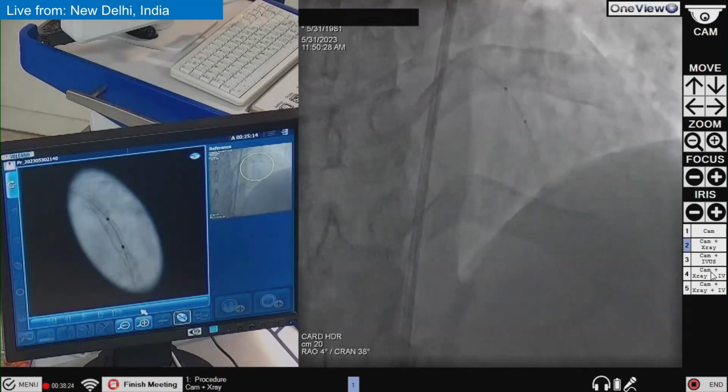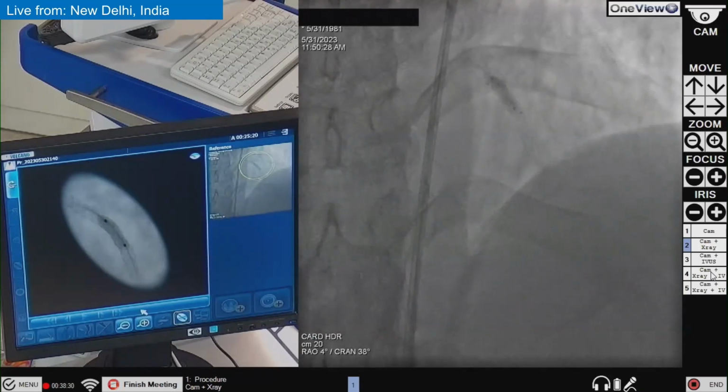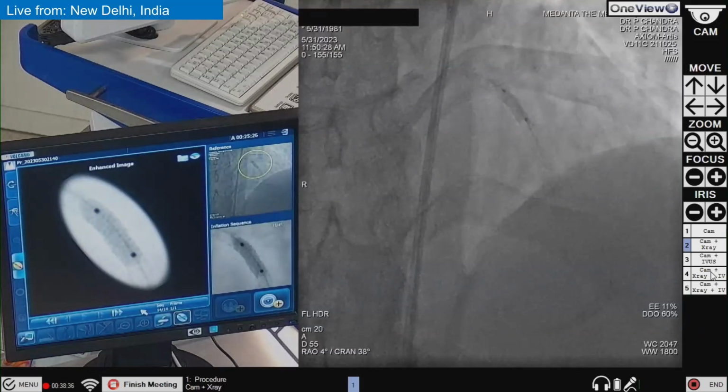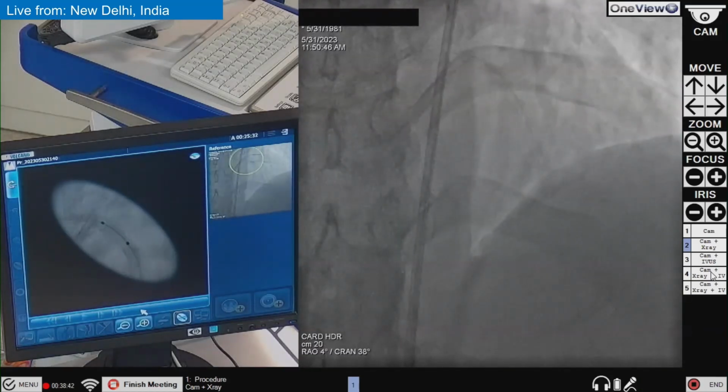Now a little bit back here. You can see very clearly. Go up 2, 4, 6, 8, 10, 12, 14, 16, 18, 20. Deflate. That is good. Now it is good. So everything up till now seems all right. And so I'll take this out.